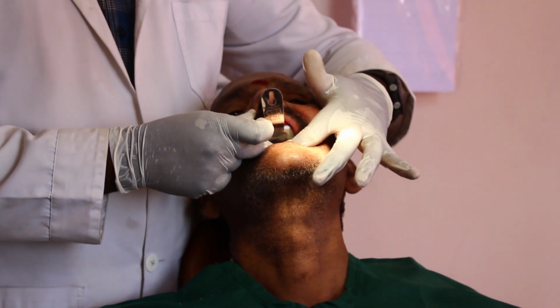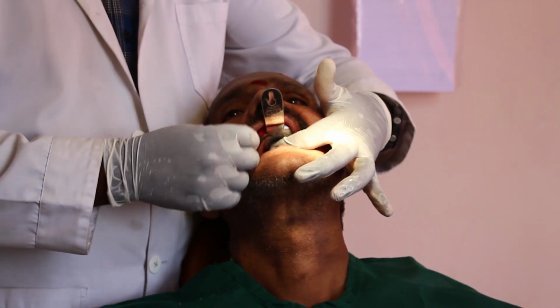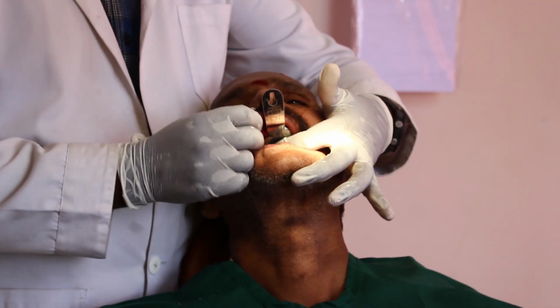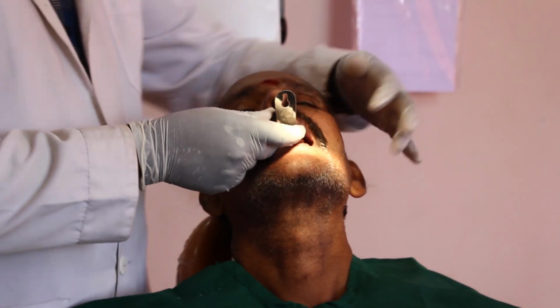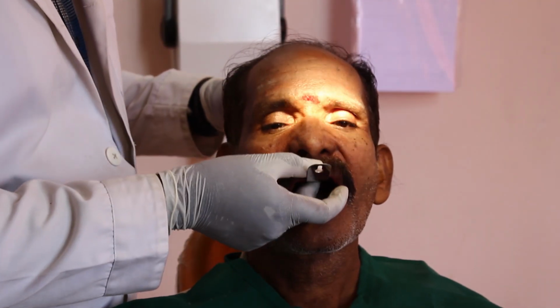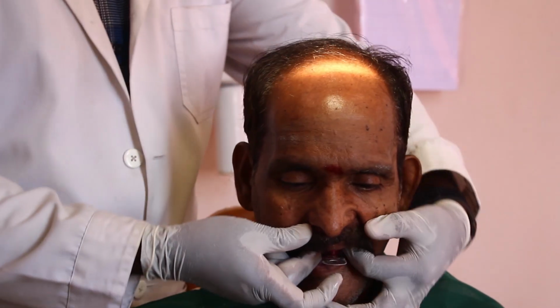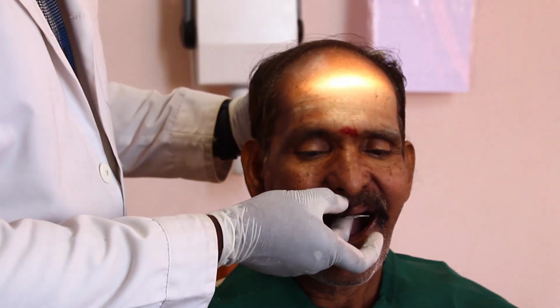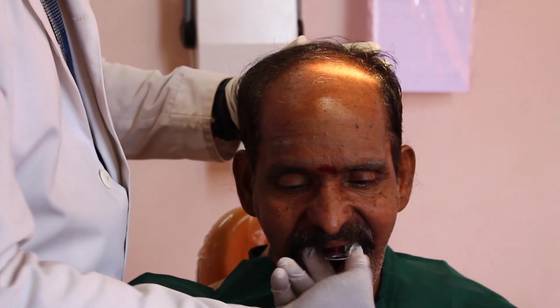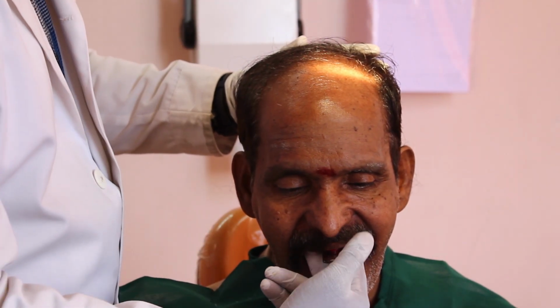And similarly, you have to change the hand and hold with the other hand, and then record the mold on the other side. And ask the patient to bend forward. Bend forward. By which we are activating the soft palate to descend down, so we are going to record the posterior palatal seal area better.